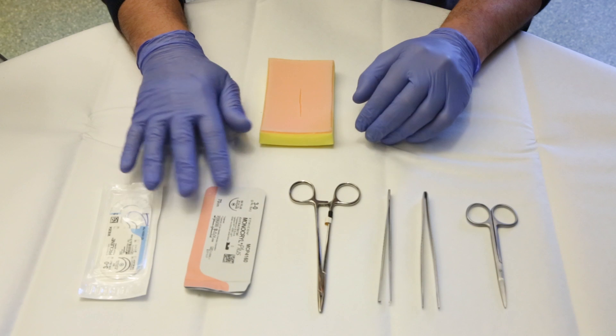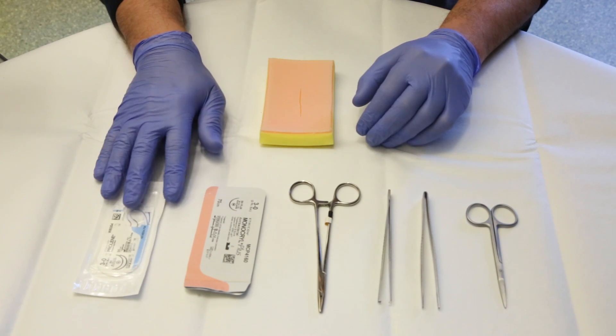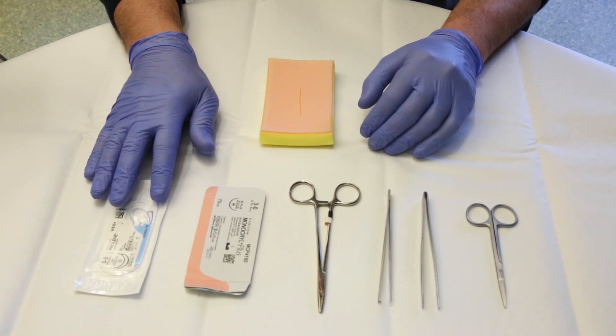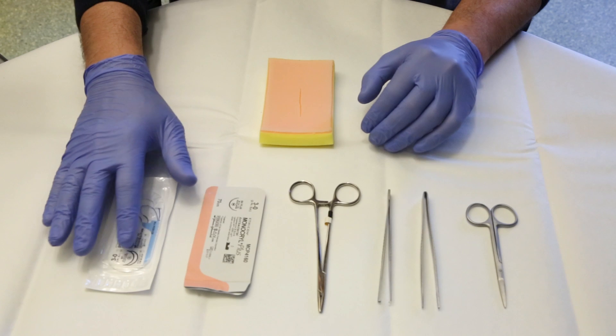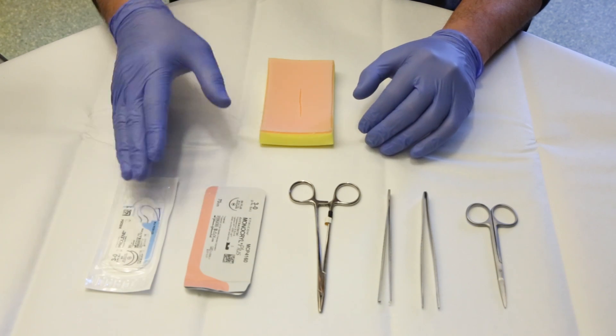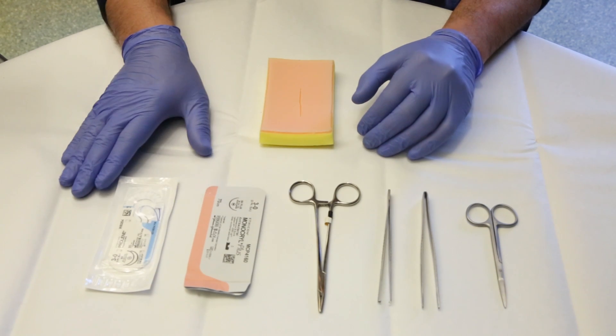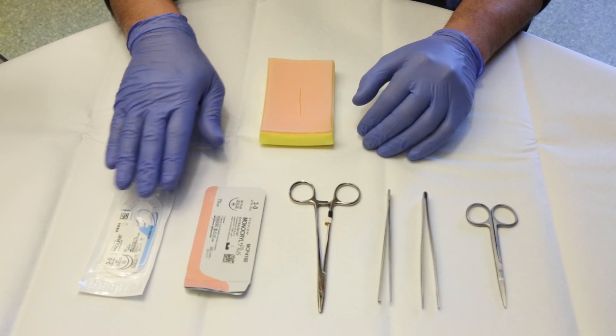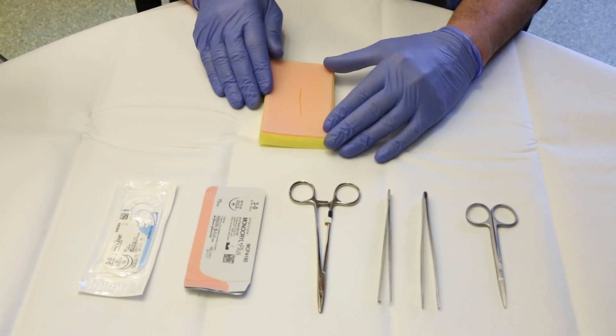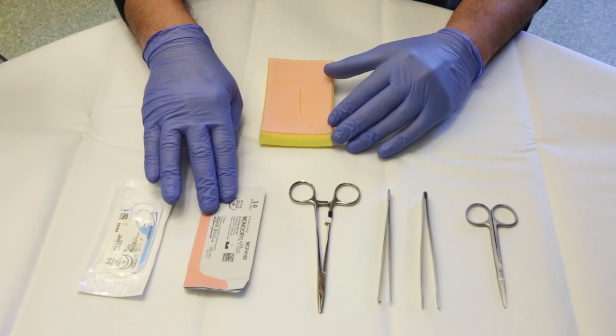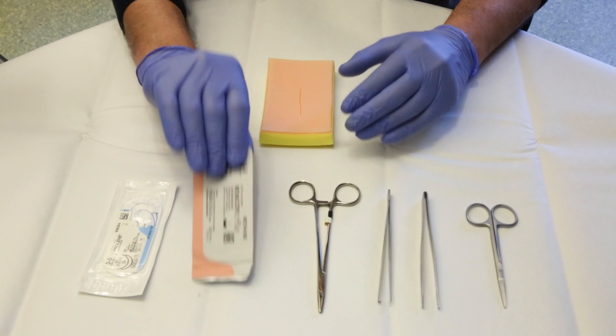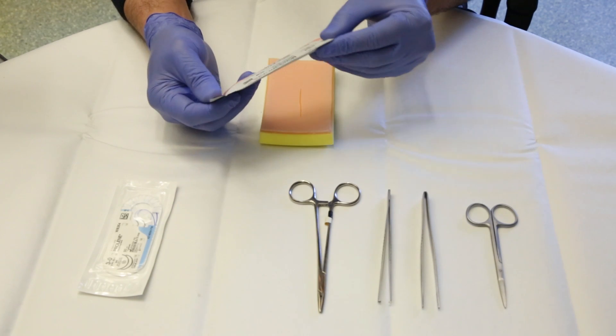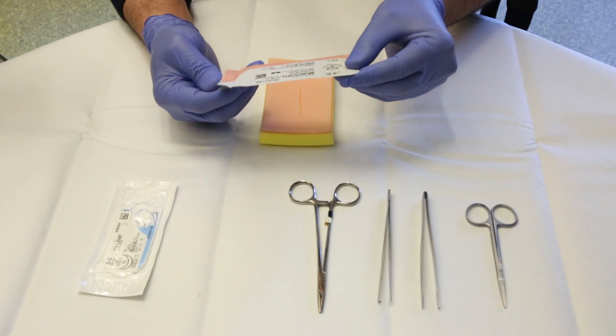In regards to the stitches, there are different types of stitches, different on the needle type or the stitch type, the size of it. Today we'll demonstrate a simple stitch with a 3-0 monokryl stitch.